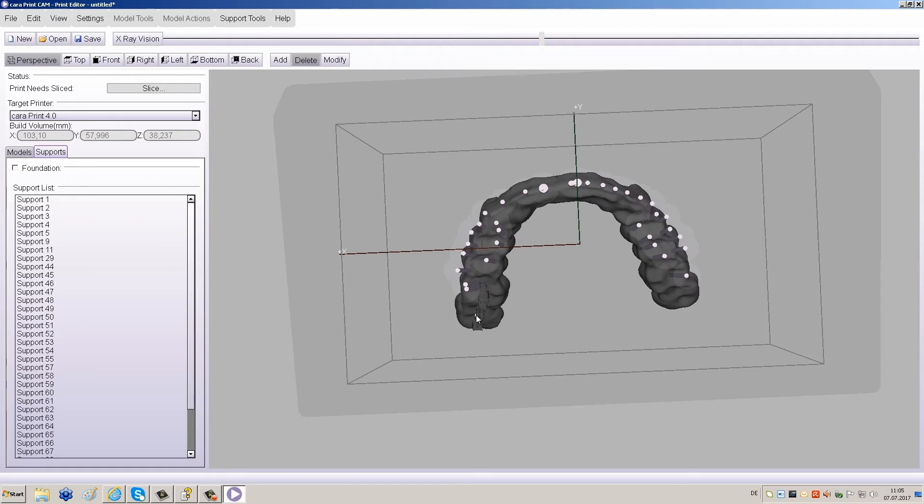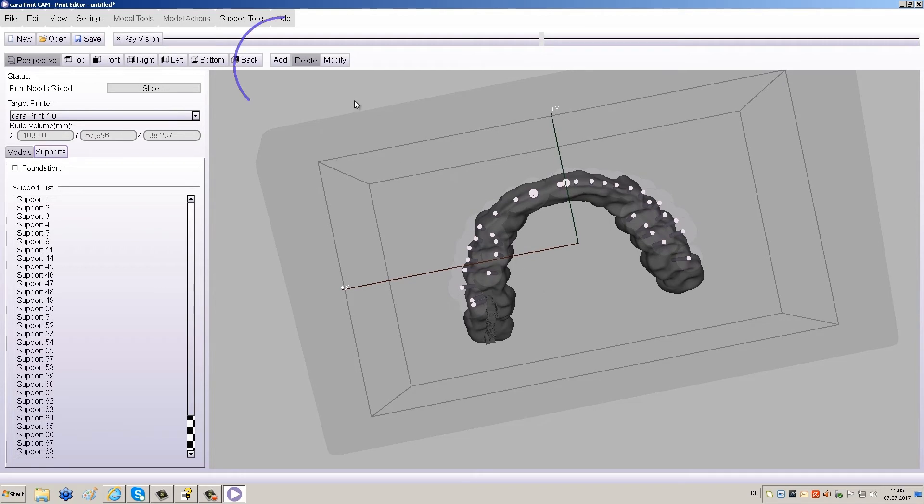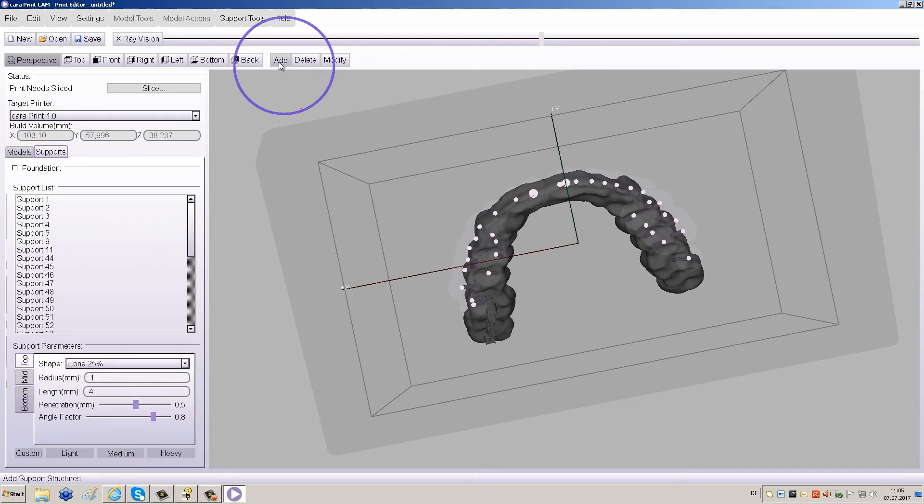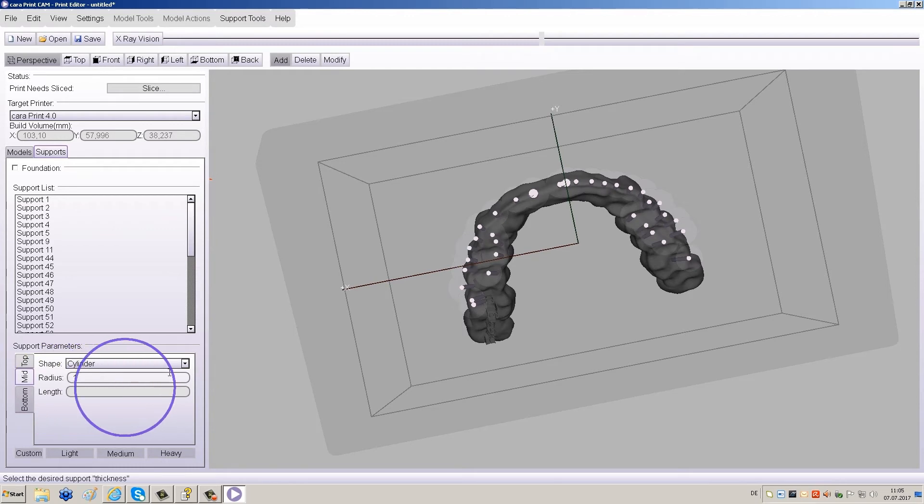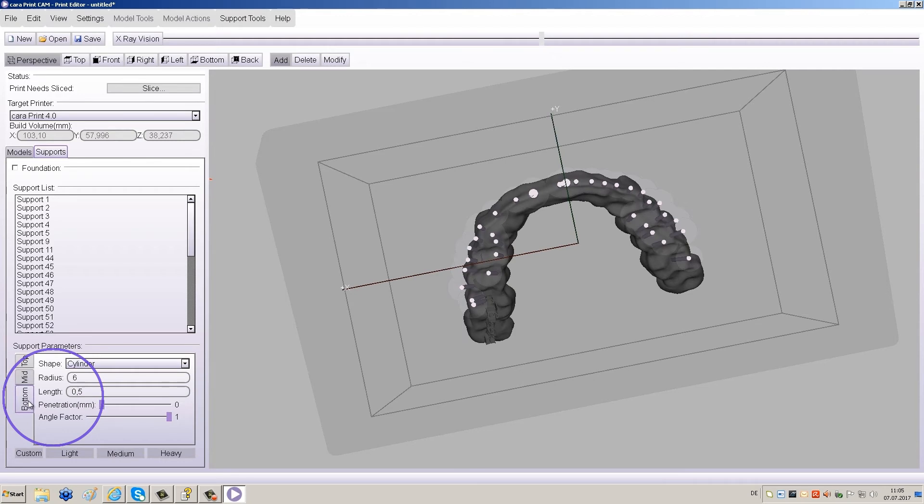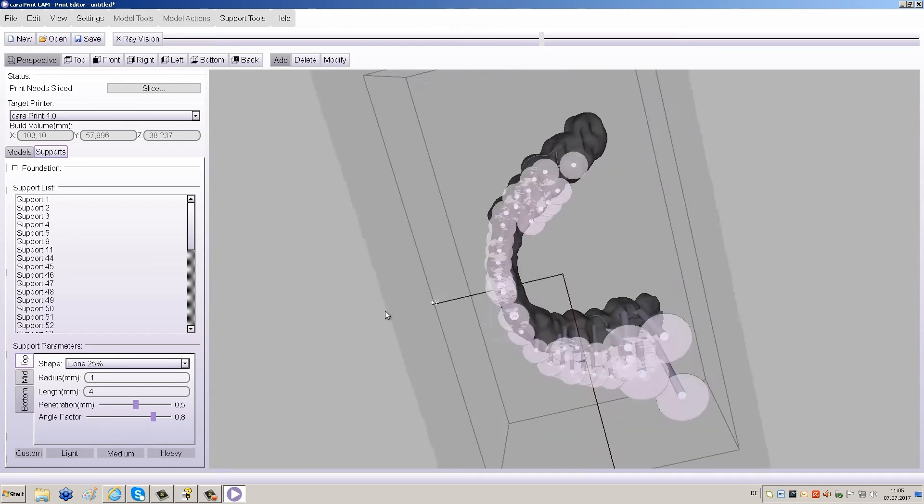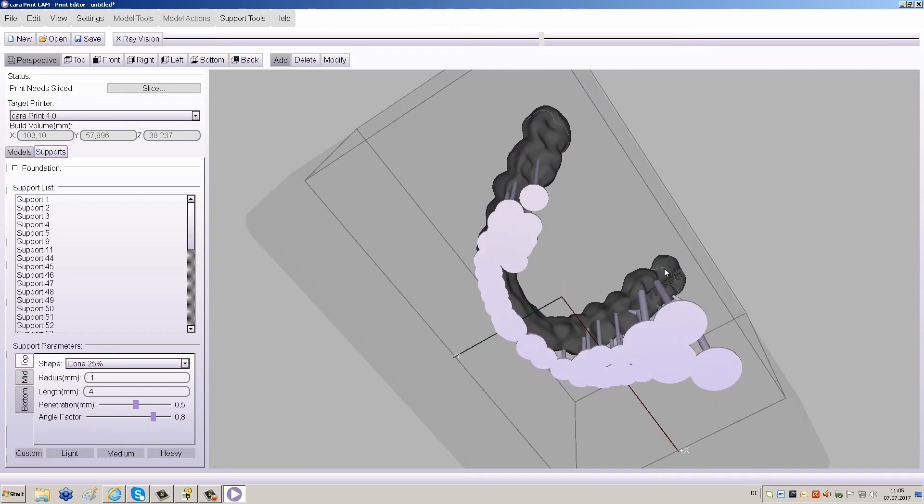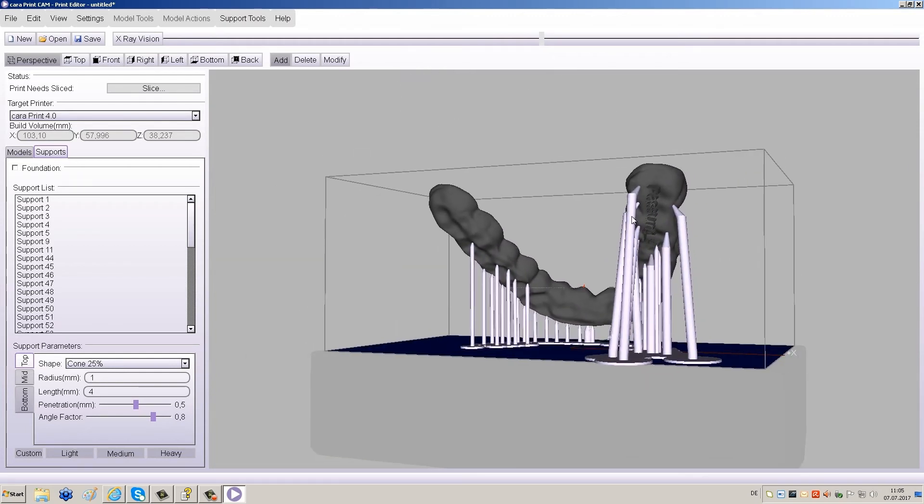For splints, we recommend using the thicker supports labeled Medium. Click Add and adjust the settings under Support Parameters. If not already done by the Automatic Support Generation tool, make sure that the first supports touching the object prevent the object from rotation for more reliable results. Make sure the shape is set to Cylinder under Mid and Bottom. Under Top, the settings should be Cone 25%. Then click Medium at the bottom of the screen.